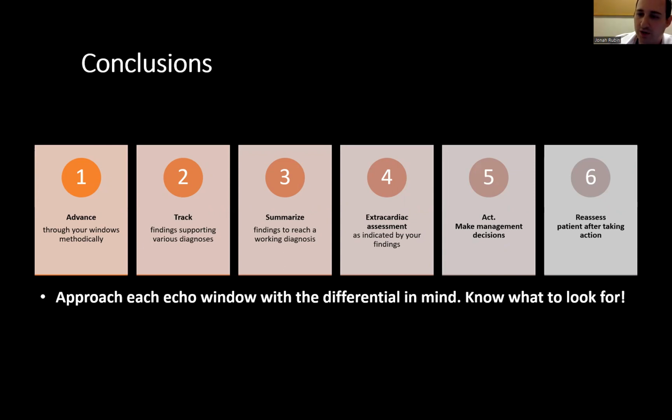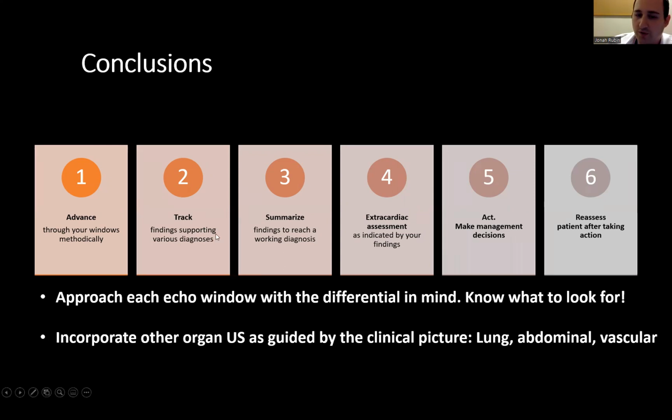We approach each window with the differential in mind, knowing what to look for. We incorporate other organ ultrasound as guided by the clinical picture, and we have to know our own limitations. And then the more we do this, the better we get at it.